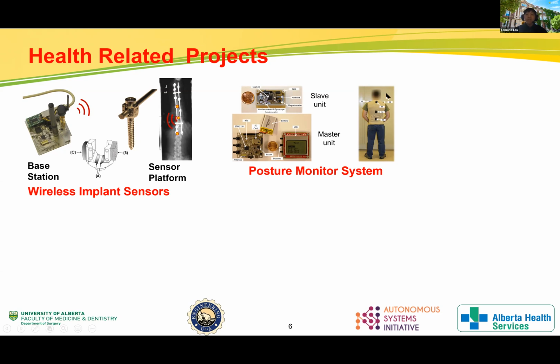One of my master students also tested the network, and it has already been used by many patients. Some of the patients get a good result on their curvature. So this is one type of technology that we spun off from the lab to translate into clinical use.